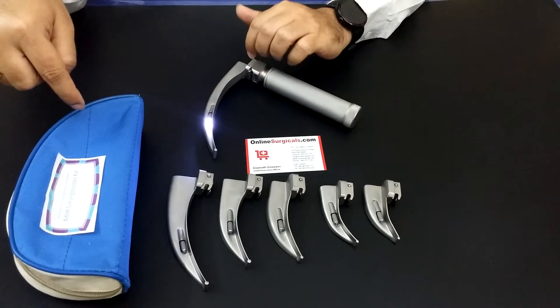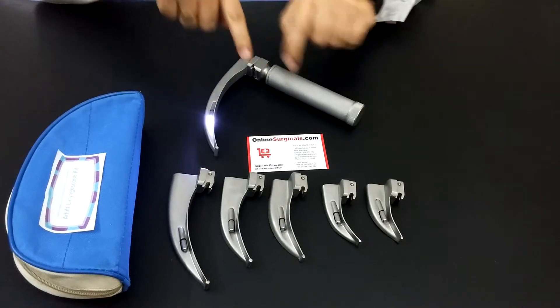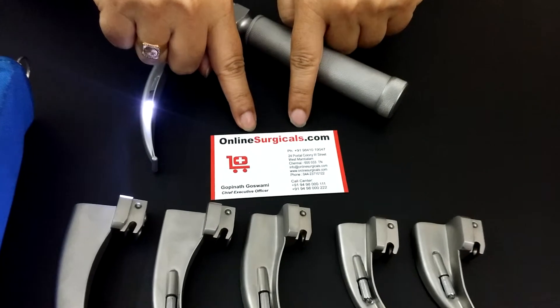They are supplied in a pouch like this. To buy this product, visit OnlineSurgicals.com.